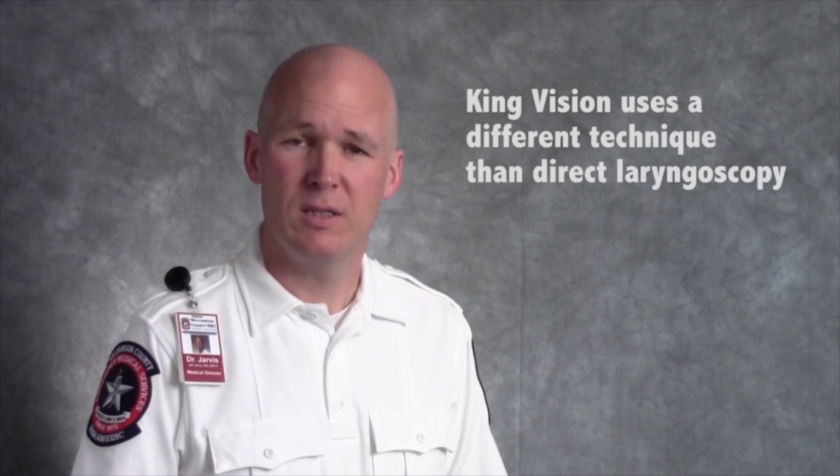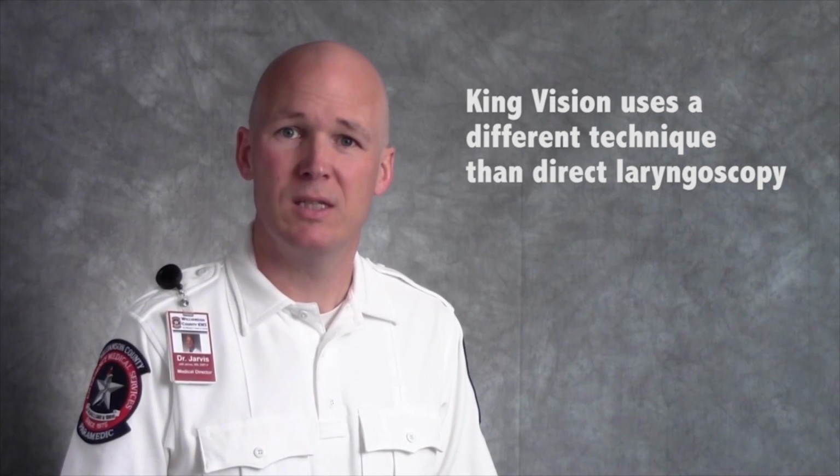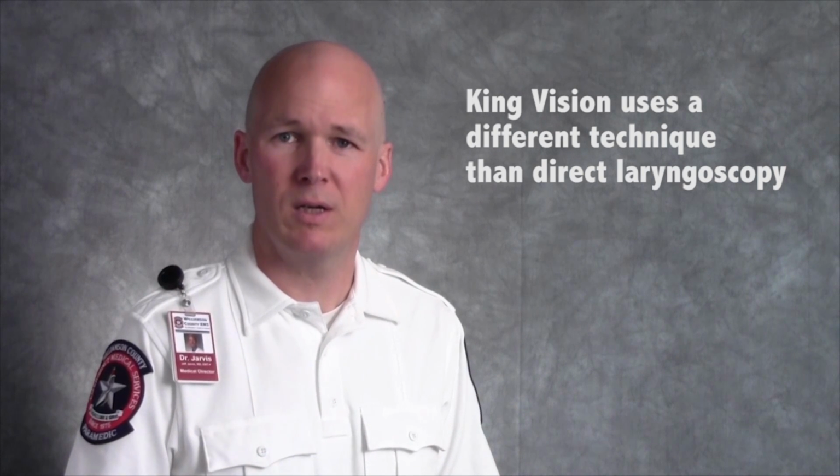Perhaps the most important thing I learned about using this device is that video laryngoscopy, at least with this and similar devices, is not the same skill as direct laryngoscopy. Using the King Vision, just like you would a direct laryngoscope, is asking for failure. There are certainly some similarities between the two, like preparatory steps and oxygenation, the anatomy, for example, but the actual psychomotor skill of how to use this device is fundamentally different. Most of our initial failures were because we didn't understand this distinction.